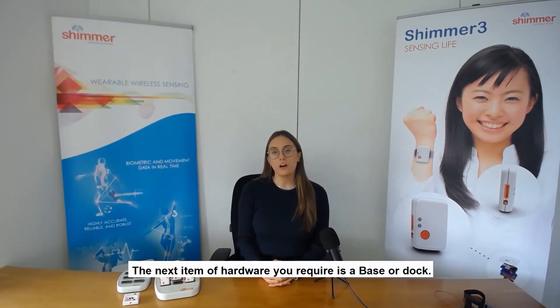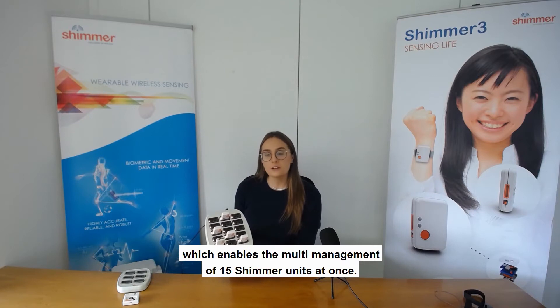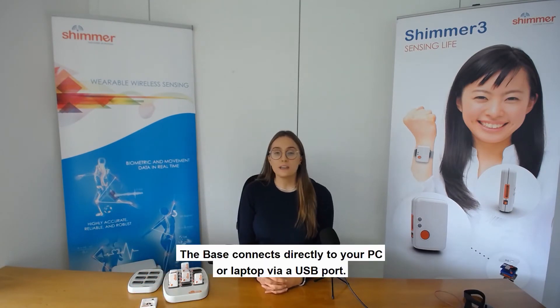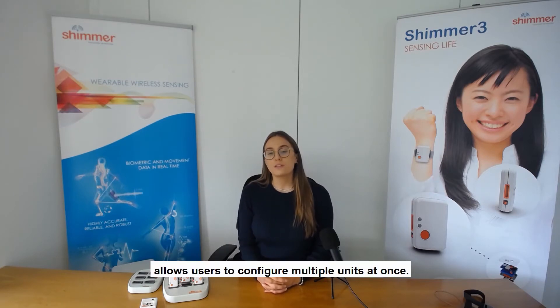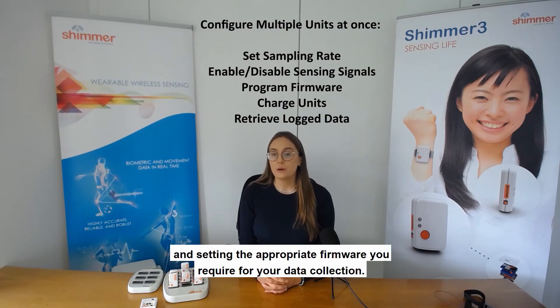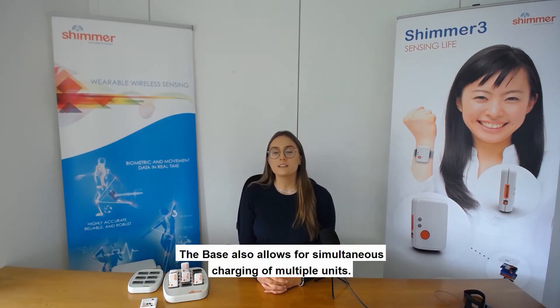The next item of hardware required is a base or dock. For today's example, you can see our Consensus Base 15, which enables the multi-management of 15 Shimmer units at once. We also have a Base 6 and a single dock for smaller quantities of sensors. The base connects directly to your PC or laptop via a USB port. The Consensus base, in conjunction with our Consensus software applications, allows users to configure multiple units at once — including setting the sampling rate, enabling or disabling sensing signals, and setting the appropriate firmware. The base also allows for simultaneous charging of multiple units.